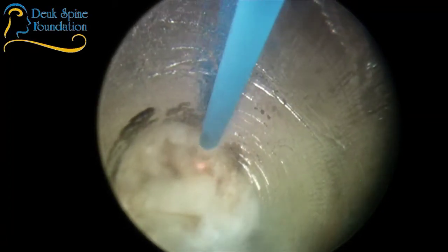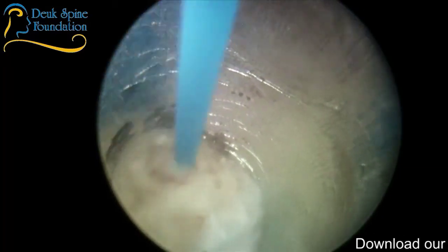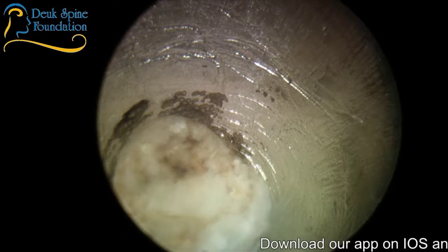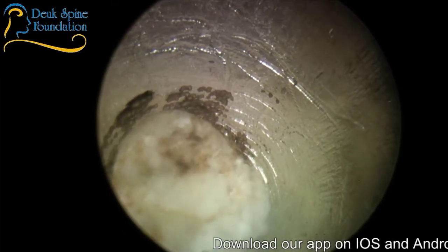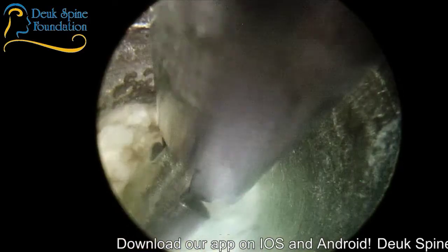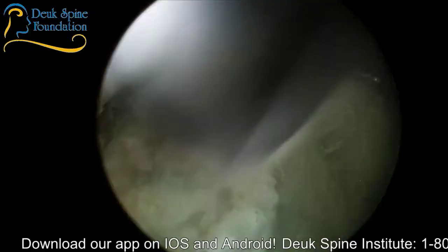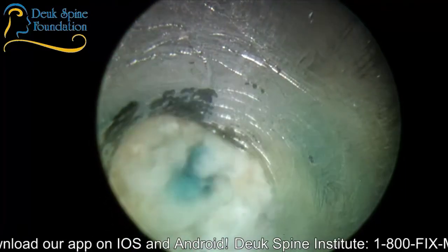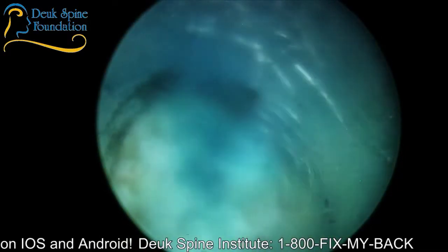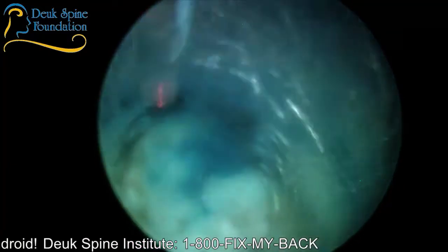Of any surgeons that do endoscopic spine surgery, let's just say there are 100 in the world, and of those 100 that know the transforaminal approach, probably only 5 of them do L5-S1, the bottom disc, even though it's the second most common disc to be affected. The reason is L5-S1 is the hardest to get to because of the angulation of the facets and the disc space. So a lot of surgeons won't even do it.